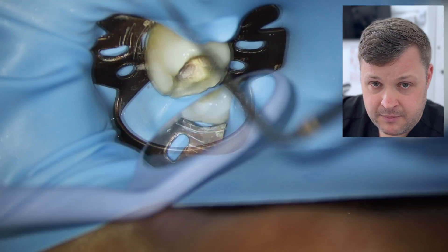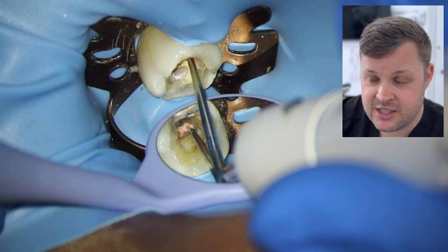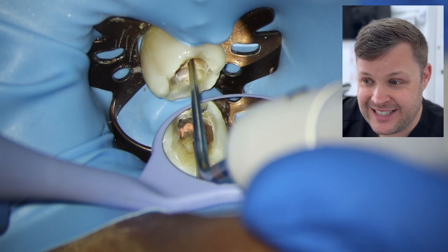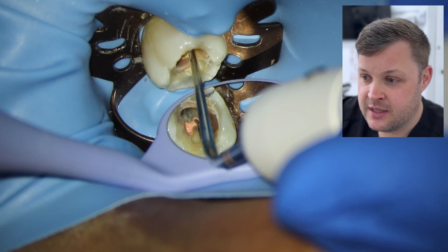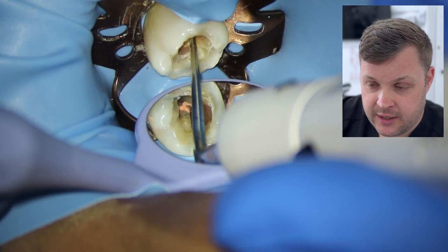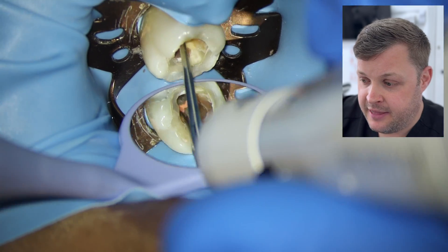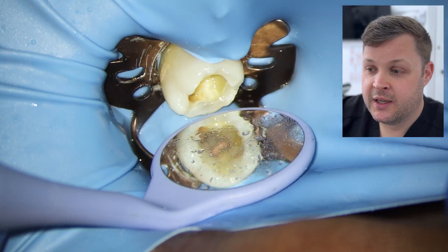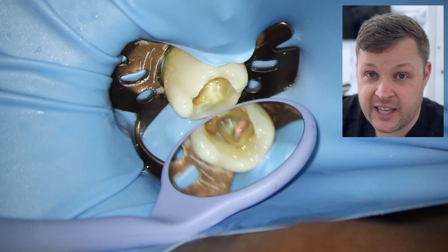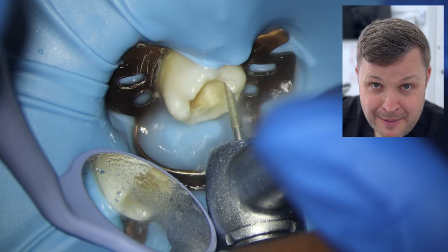Once we've done everything, we give it a clean-out. The great thing about bioceramics is you can use an ultrasonic tip to remove excess. Then we do the final adjustment of the orifices with the heated plugger to get all the excess out, and finally we use Vitrebond to seal the orifices — this is just a light-cure GIC.